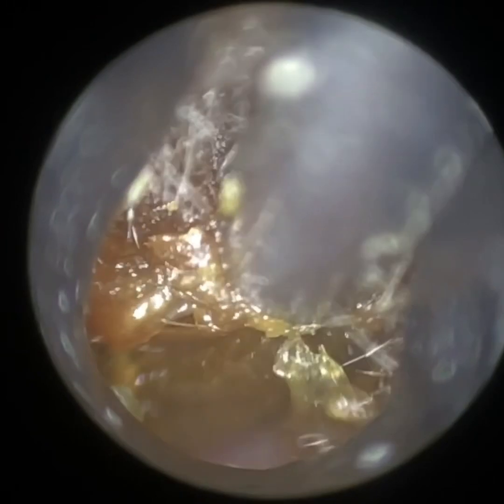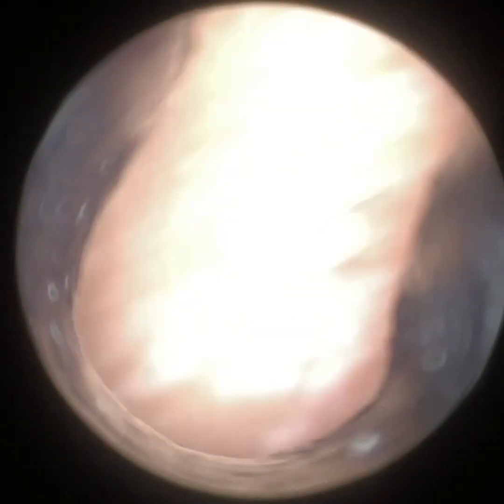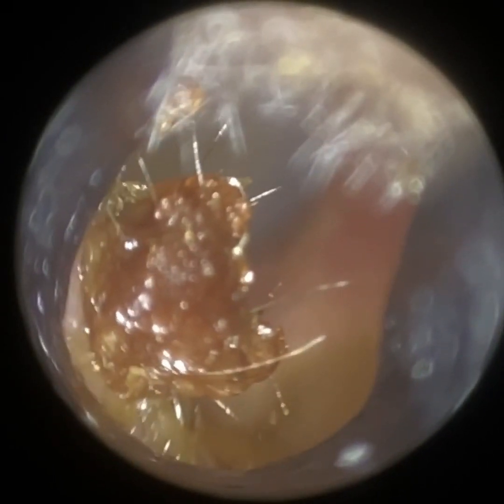I'm just using the 4.25 millimetre speculum here to dilate the ear canal, but in hindsight I should have probably used our smaller one, the 3.5, which I did in the other ear. In fact, I used it in a moment to visualise the eardrum because it was so narrow.